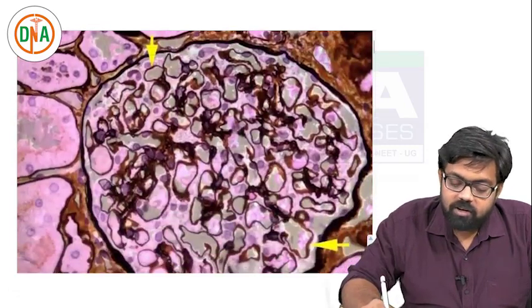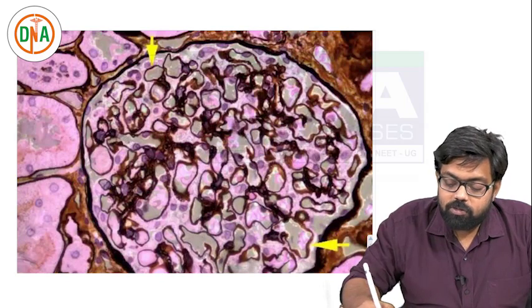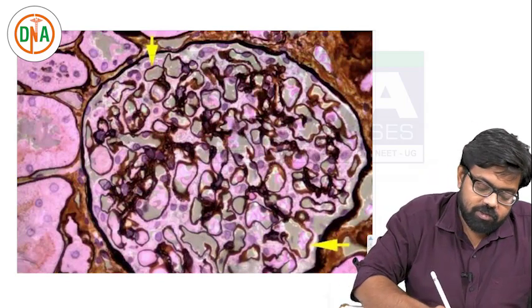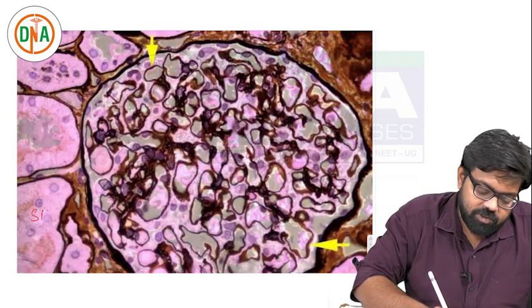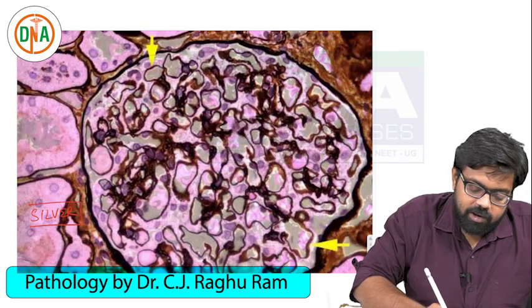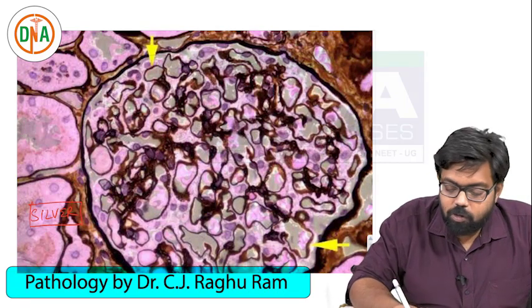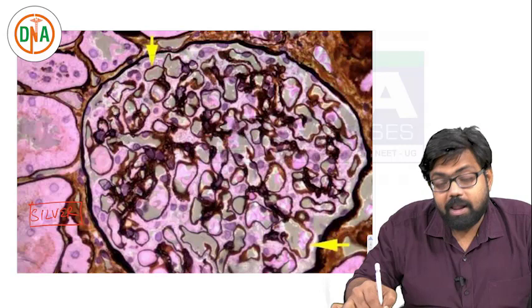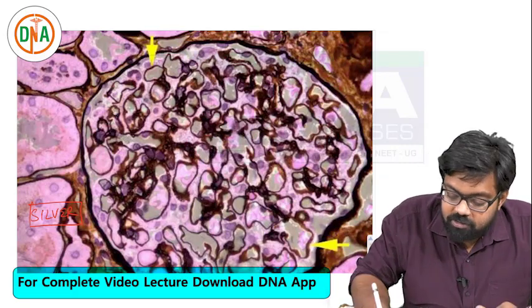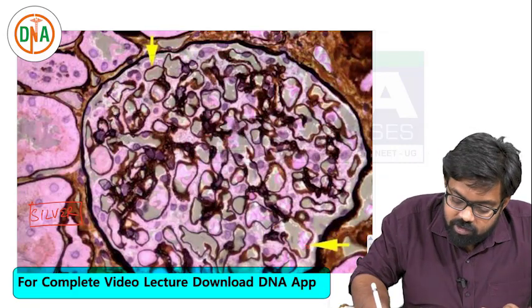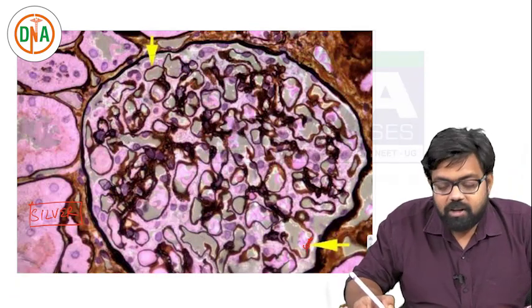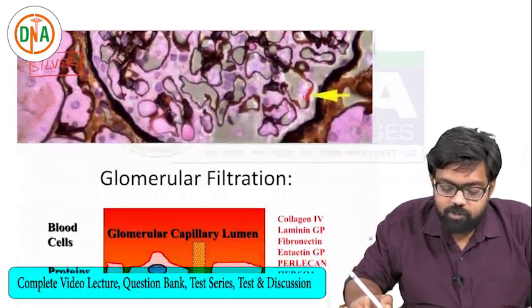Another special stain helpful to identify the membrane is the silver stain. As you know, silver stain gives a black colored appearance of the membrane. All the capillaries are having this black lining - it is nothing but the basement membrane. It is very clear here. So this is another special stain we use.